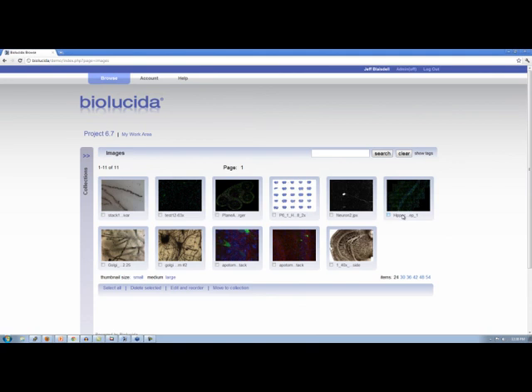Okay, right. But that really does bring up a good point, regarding other users and access to your collections. So it's important to know what happens when you add a new collection with respect to what other users in the system will see. Okay. Now, by default, all the collections that you create are private. So you're the only one that has view rights to that collection. You'll see the collection. However, other users will not actually see it. They won't even know the name of the collection that it exists.